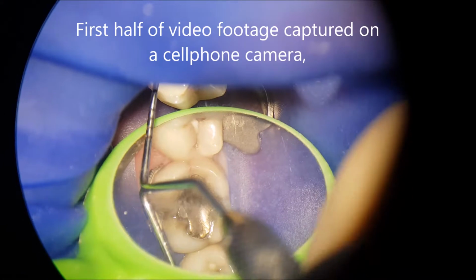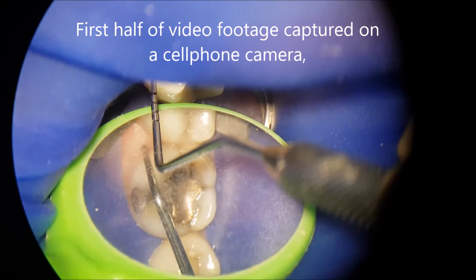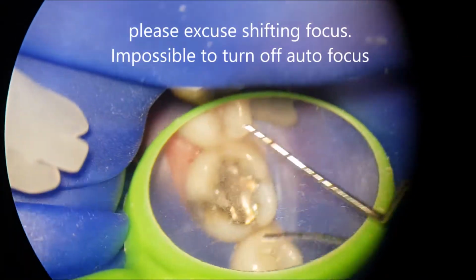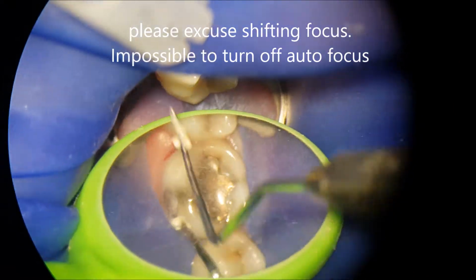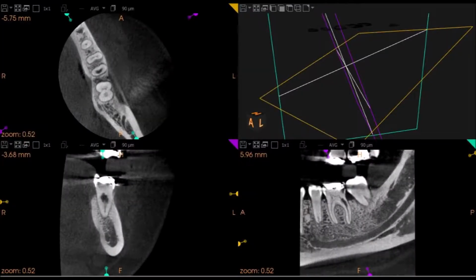I was a bit concerned about the distal bone crest, but probing didn't reveal anything out of the ordinary. Probing seems a bit tedious these days with the dawn of the cone beam CT. However, I prefer to routinely probe all my endo cases on the off chance that there is something wrong that isn't picked up on the CT scan. In the end, I did refer this one for a CT scan purely because I was a little bit in doubt as to why that shadow is distal of the 3/6, and I'm glad I did.